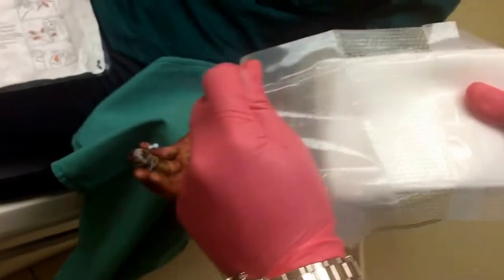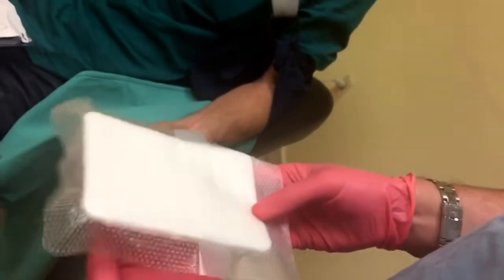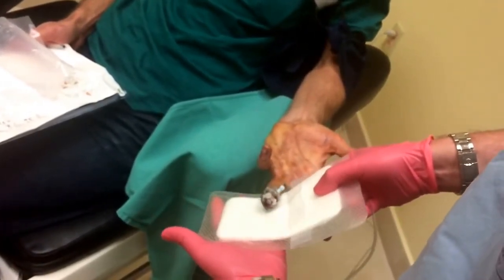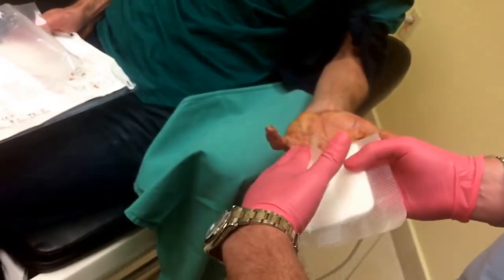It does have adhesives. So you see, I'm going to pull it like that. This is the sticky side. This actually is okay to go onto the patient's skin — it's not a problem. So what I'm going to do is spread your fingers like this. And I call this the taco technique.